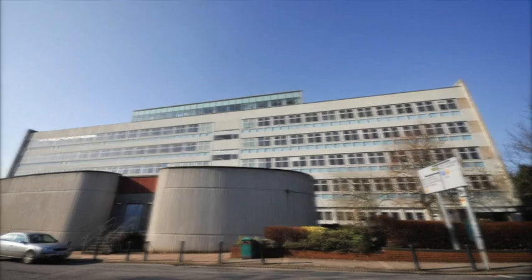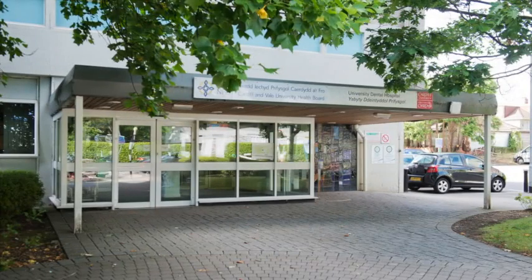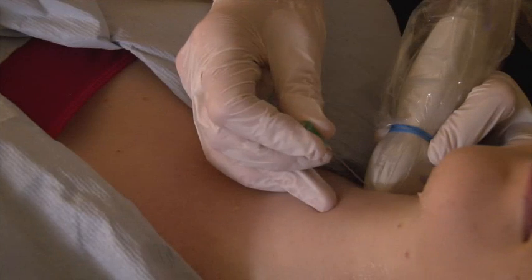Welcome to the Dental Radiology Department at the University Dental Hospital in Cardiff. This short presentation will guide you through what to expect when you attend for an ultrasound guided biopsy.